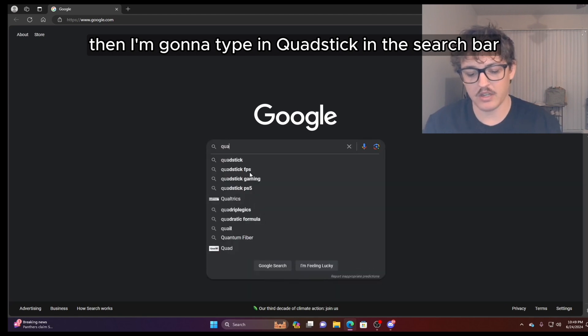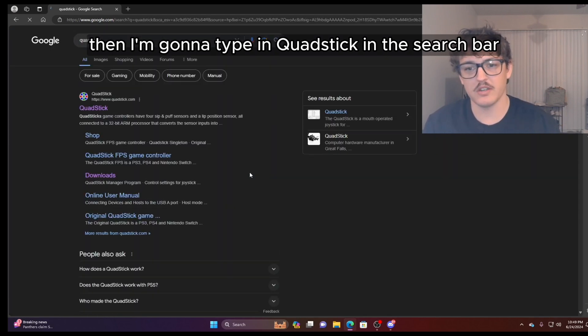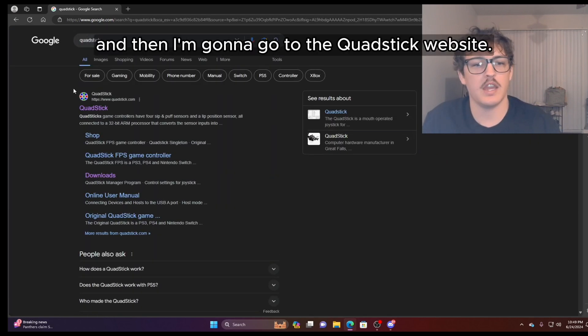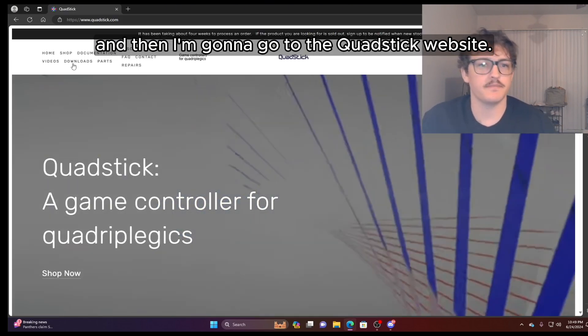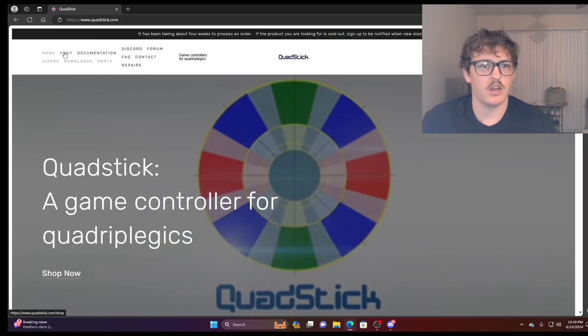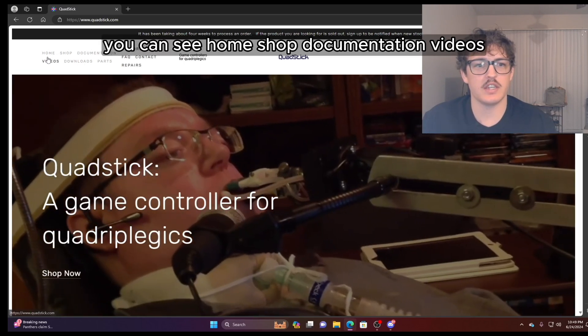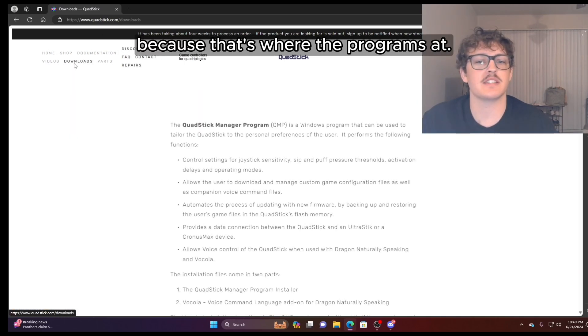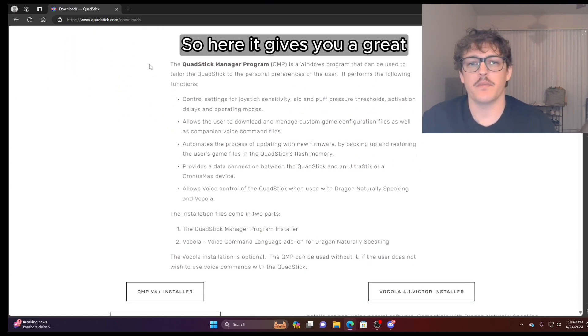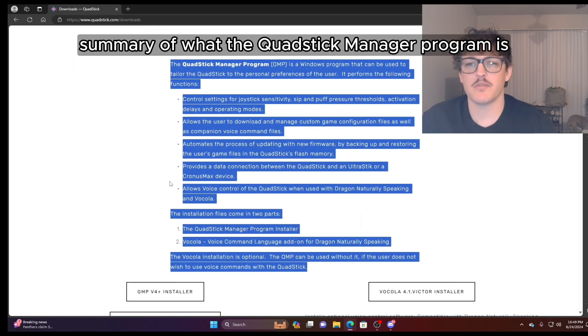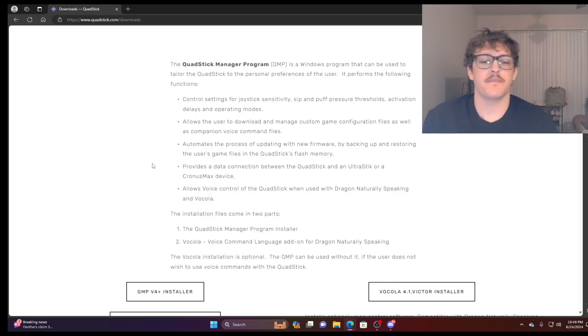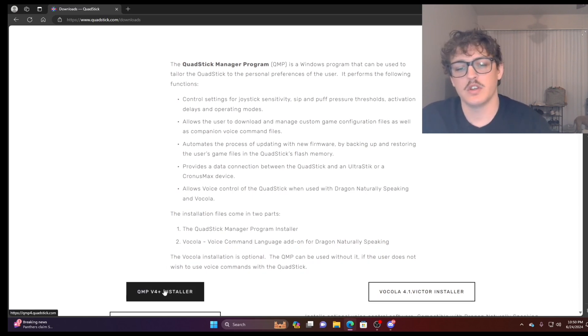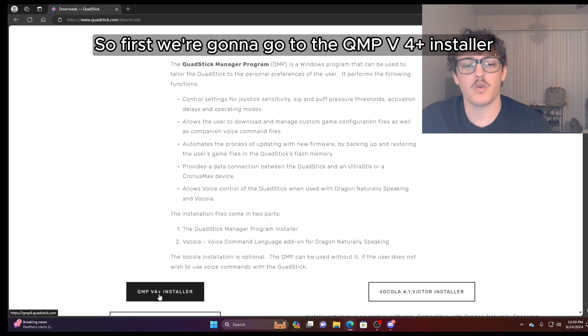So I'm going to open Edge and then I'm going to go to Google. Then I'm going to type in QuadStick in the search bar. And then I'm going to go to the QuadStick website. Over here in this area you can see home, shop, documentation, videos. We're going to go to downloads because that's where the program's at. So here it gives you a great summary of what the QuadStick manager program is. And I'm going to walk you through it as well. So first, we're going to go to the QMP V4 plus installer. That's the QuadStick manager program version four plus.